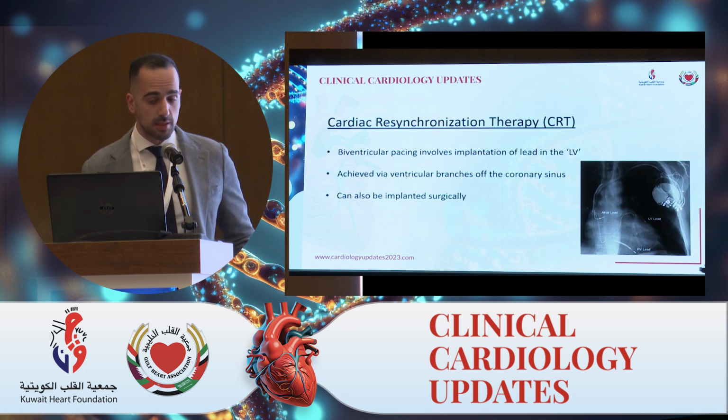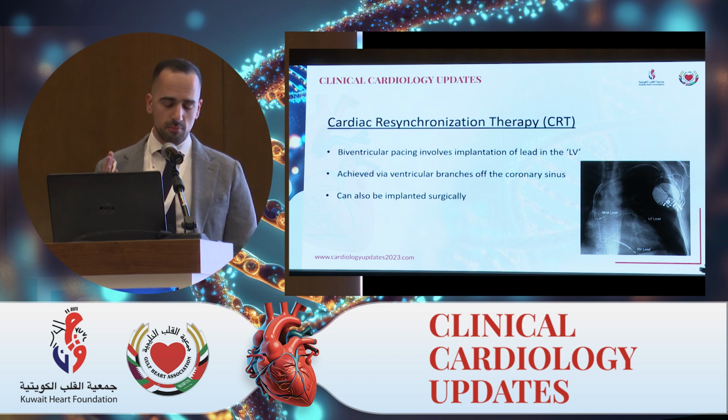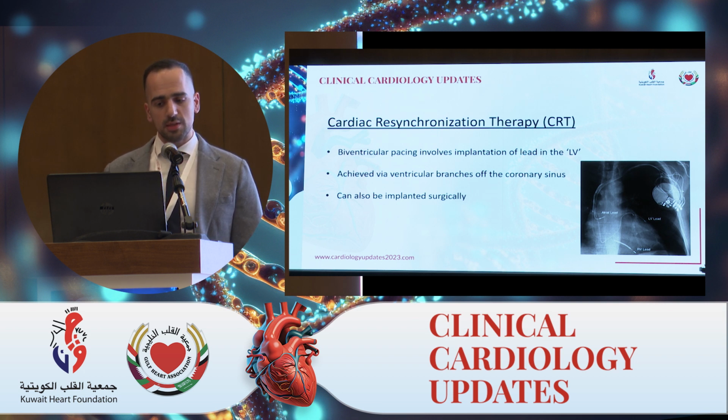And then obviously we need to discuss CRT, or cardiac resynchronization therapy. This has gained a lot of traction and it's been for a while now, but it's still the mainstay of managing patients who have distal conduction disease. It is an attempt at trying to synchronize or simulate native conduction in the ventricles. As you know, your His-Purkinje system is a high-speed network and allows your ventricles to depolarize in a very nice simultaneous fashion. When we implant pacemakers, we usually can't simulate that since we're pacing the endocardium and it's relying on cell-to-cell conduction.